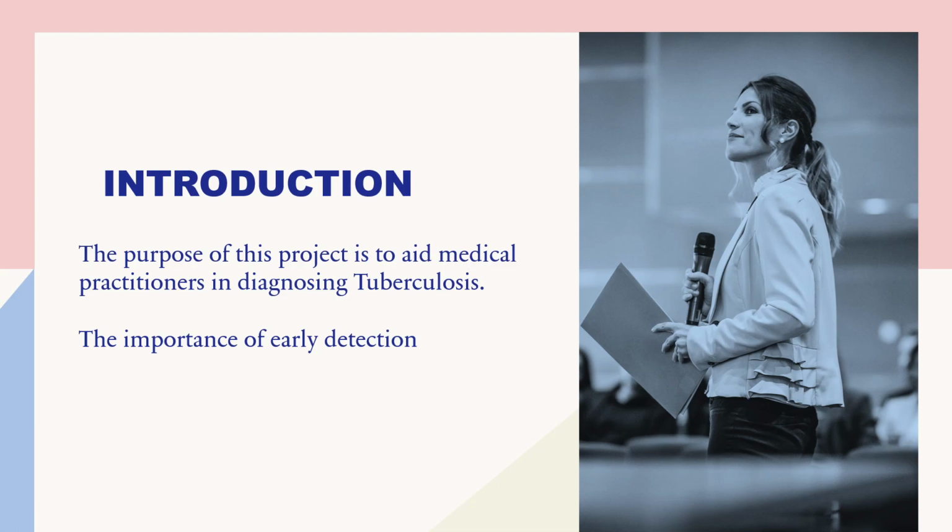The purpose of this project is to aid medical practitioners in diagnosing tuberculosis, a disease that affects millions globally each year. With early and accurate detection, medical professionals can make informed decisions, initiate treatment sooner, and ultimately save lives.